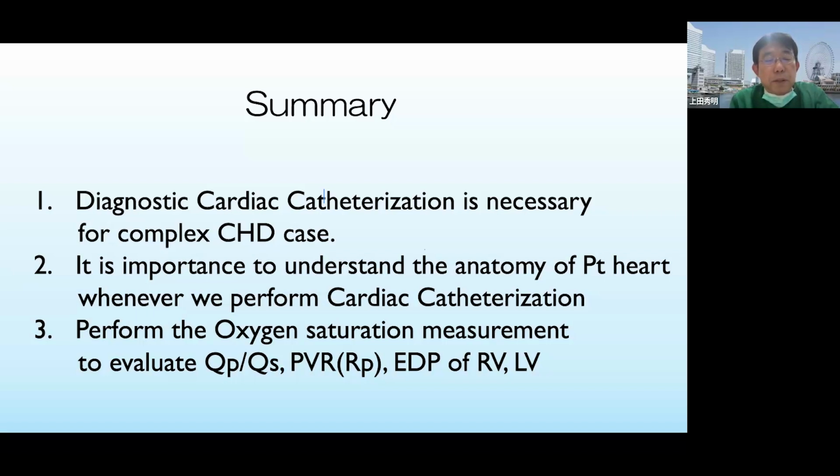If you consider the high resistance of the pulmonary artery, I think we should divide it into just the diagnostic catheterization, with careful measurement and calculation. If you are convinced that the procedure might do something good for the child, then we should move on to the next catheter interventions.